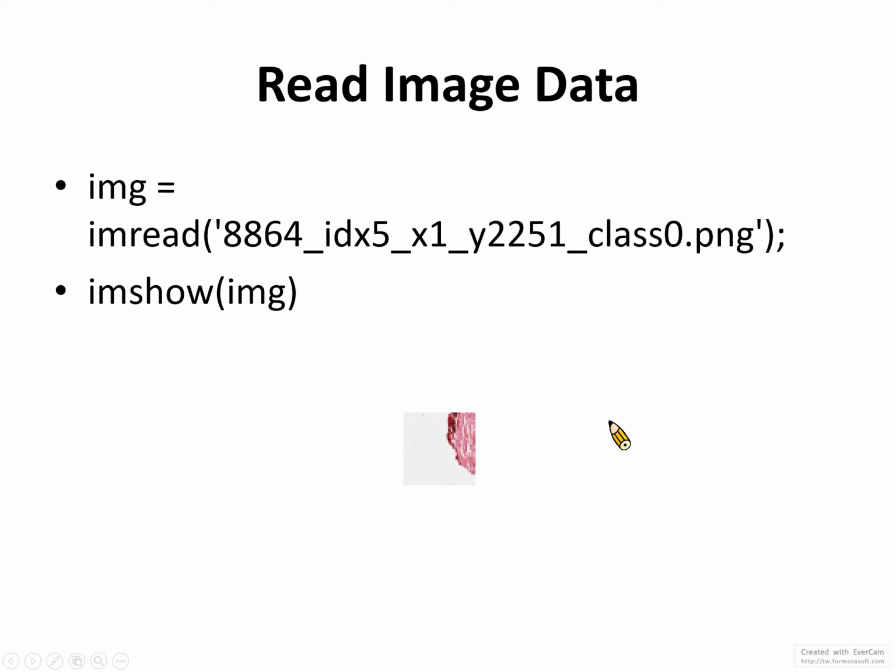Because it's 50 by 50 pixels, the resolution is not very good, but it's just a very small part of the tissue from the whole slide imaging scan.